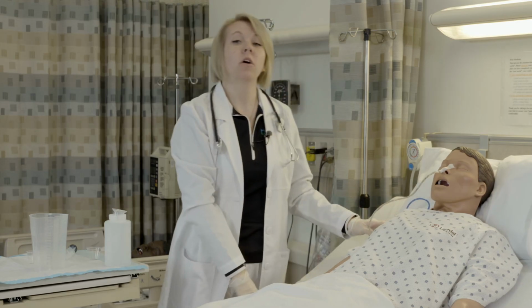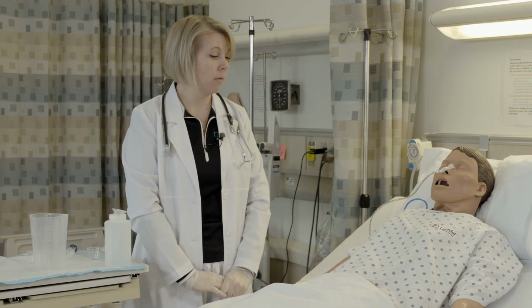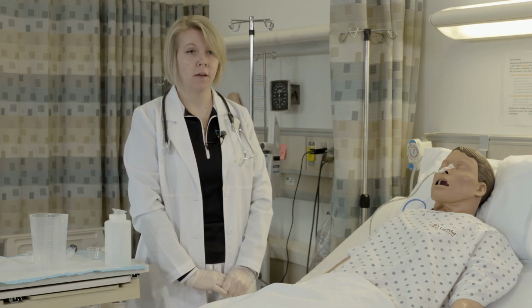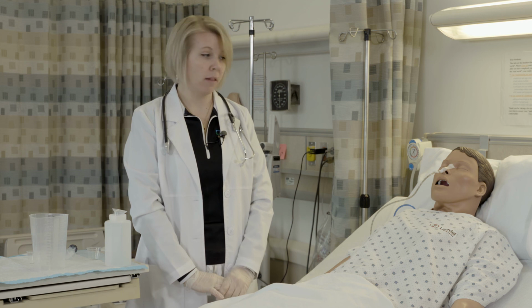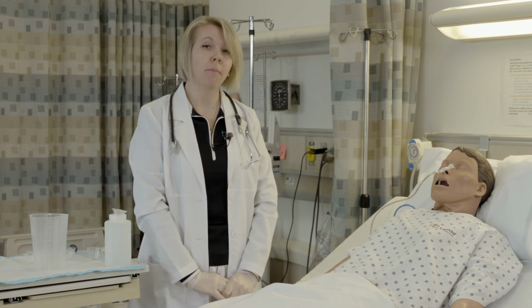we can hand our patient a call light, make sure he's in a safe position, and then come back and check on him within an hour. And keep his head of the bed elevated for 1 hour after the medications just to make sure that it doesn't come back up the tube.